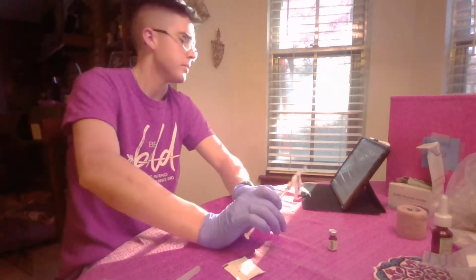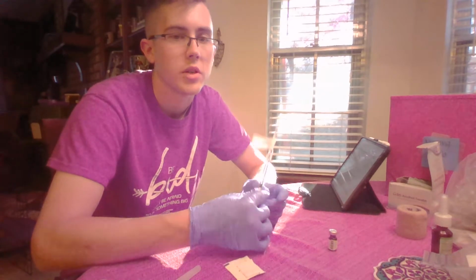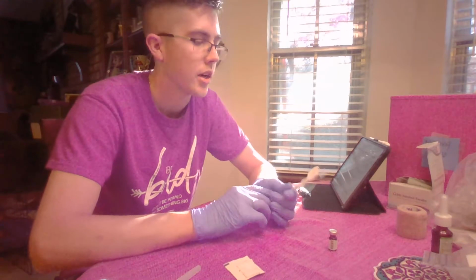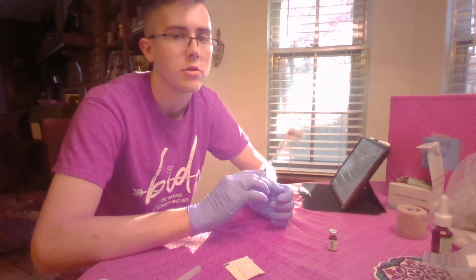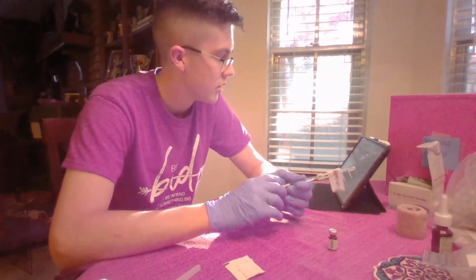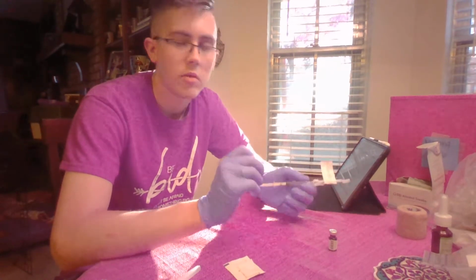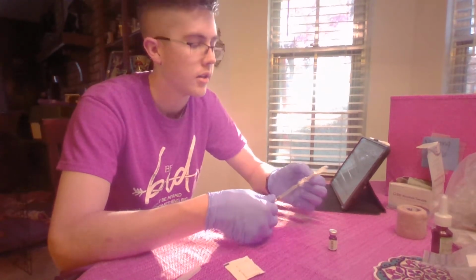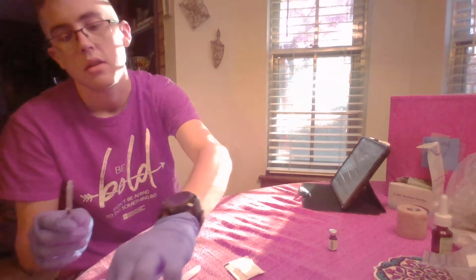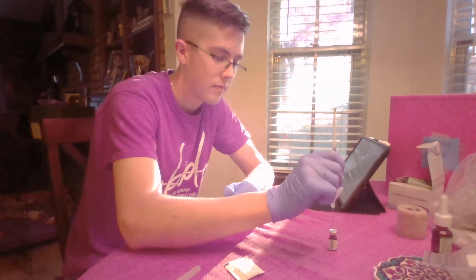I will check their nostrils to determine which one is the largest, as well as see which one has the least amount of damage and is the least obstructed. Once I discover that, I will insert the atomizer into the nostril, and I will go 1, 2, 3, and push all the medication briskly. And then I will dispose of everything in the sharps container, and I will immediately resume ventilation and monitor my patient for any signs of non-desired side effects.